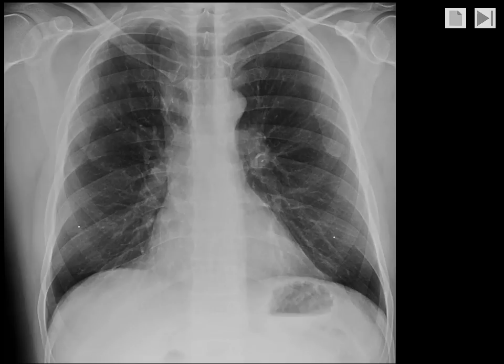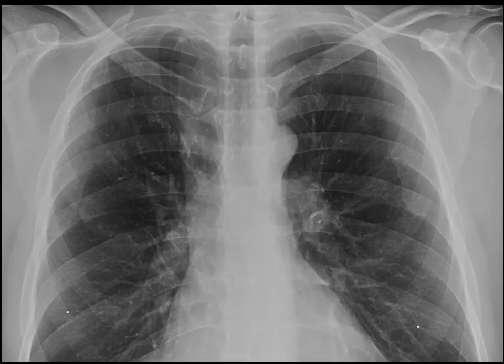Here is another patient, this time a man. We can see a widened edge on the right side of the mediastinum, and just lateral to it, we see a very thin white line. If we magnify this, we can see the edge of the superior vena cava.